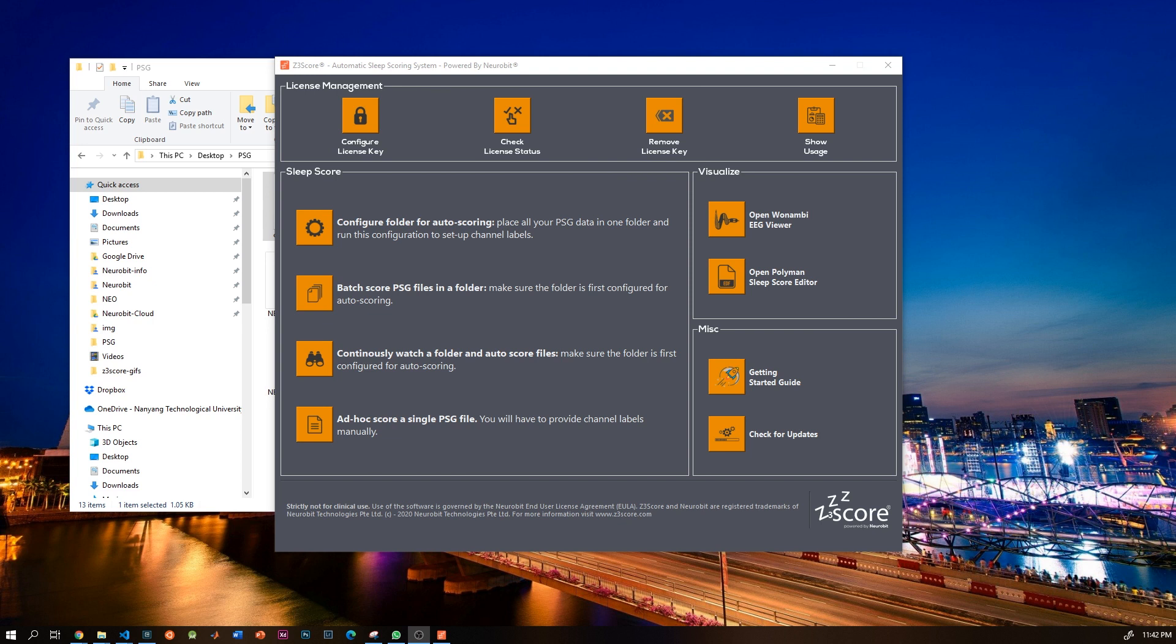Now let's move on to the more exciting part, which is our no-click integration, wherein you continuously watch a folder for new data and score them as and when they appear. So press continuously watch folder and select a folder which is already configured.